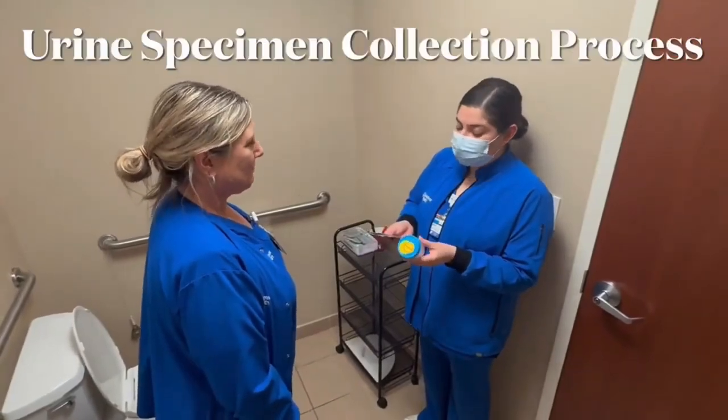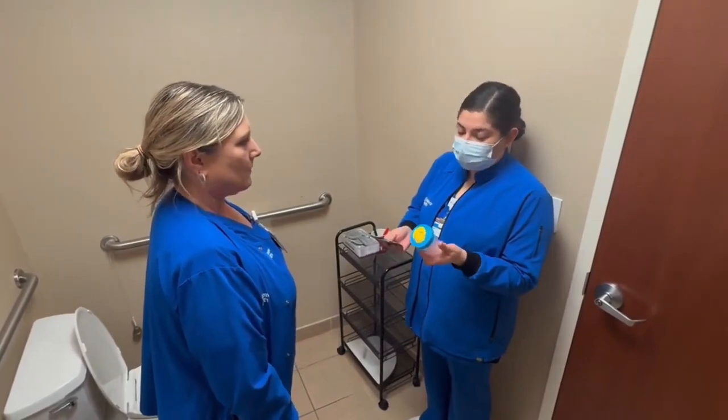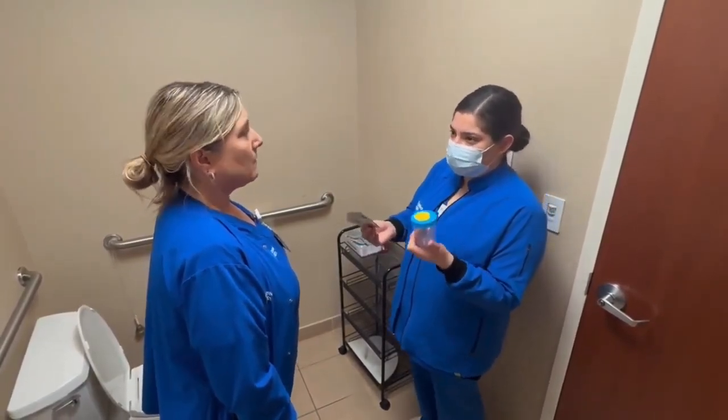Hi Kelly, I'm going to be collecting a urine sample from you that the doctor ordered. I'm going to be handing you a sterile cup and two towelettes, and you will label this container with your information.